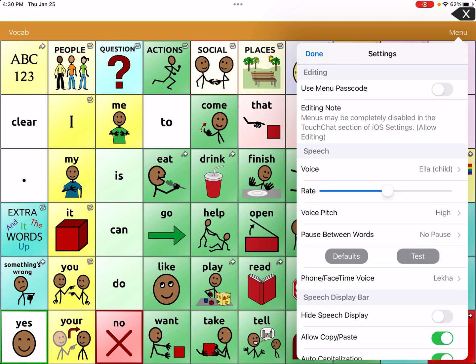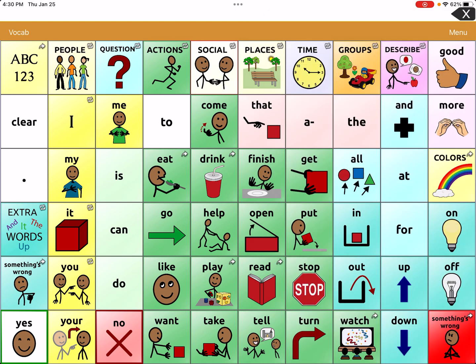Once you have your rate and your pitch, you can test it out. "This is a test of the current speech settings." So you can really reflect and choose a voice that is personal to the person using the AAC device.